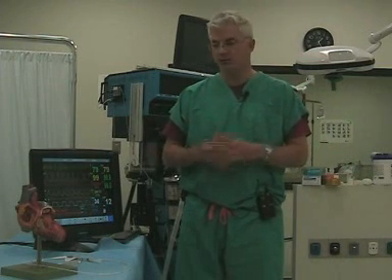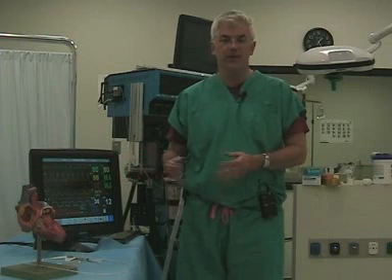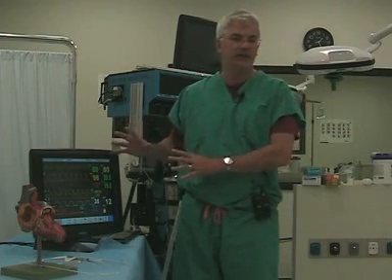Today we're going to talk about what the Swan numbers mean. If you're on the cardiac rotation, you're sure to be using Swans, and it's a good idea to know exactly what the numbers mean. This video is going to explain how we work in a practical way with the numbers that the Swan gives us.